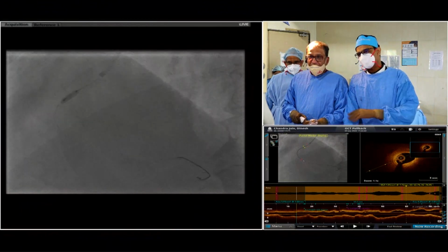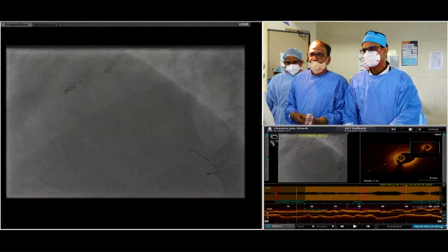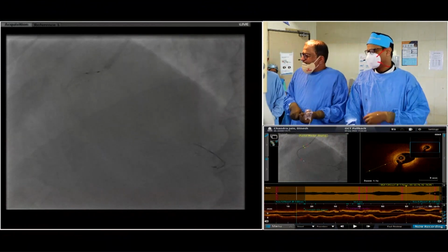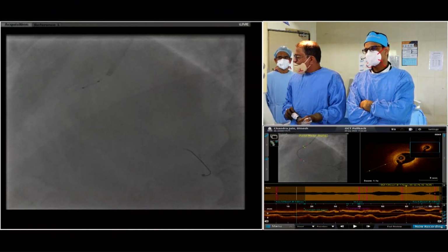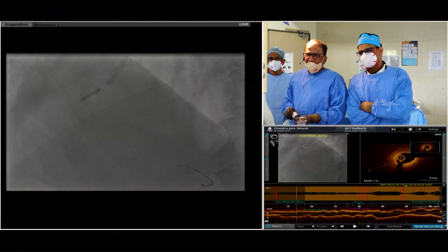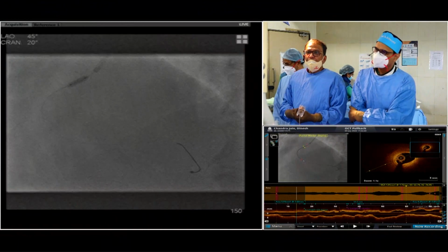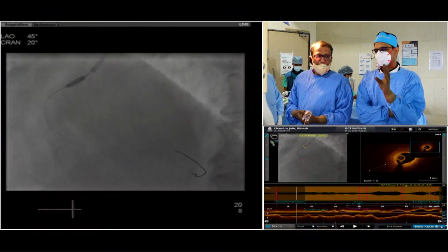So your strategy will be to perform focal stenting or to take one long stent? I think we'll need 2 stents here. From what we saw, it is coming to 56 millimeters. So we're using a 38 millimeter, 2.75 Alpine. We'll just hold it there, sir.